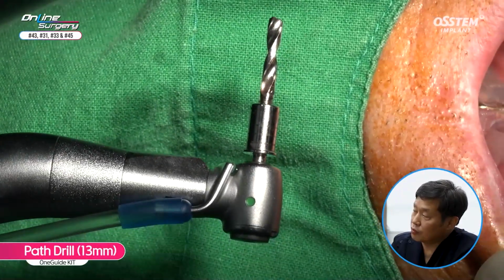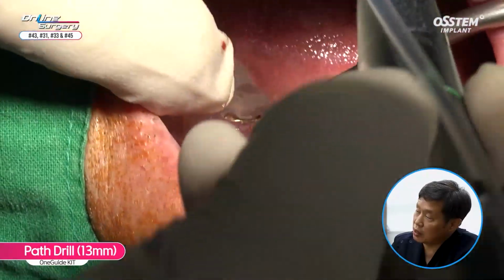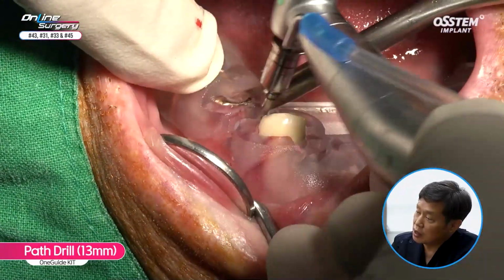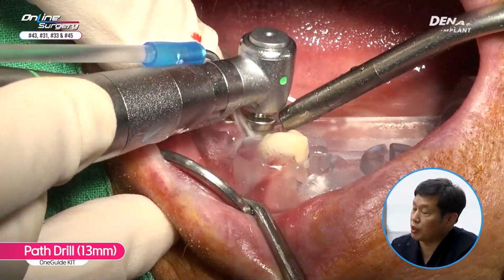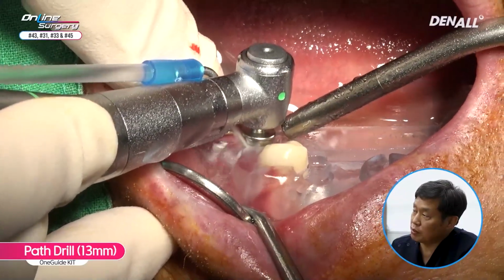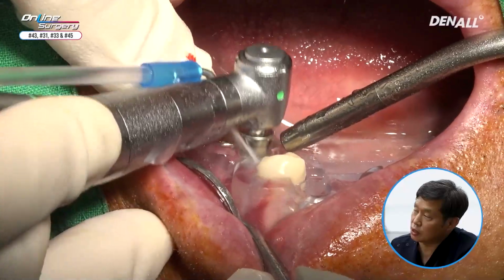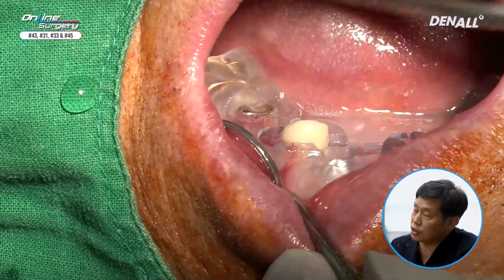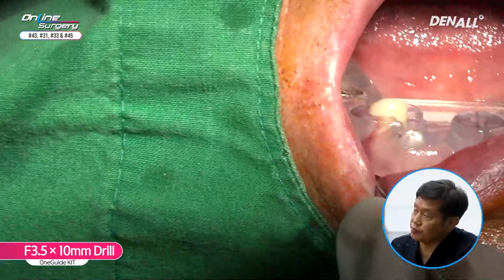2-point contact was utilized so that there's more stability. In the case of extraction socket, the 7mm, you may not come in contact. And now it's a 13mm path drill. The plan was to place a 10mm implant, so you could do drilling up to this point to prevent any slipping.